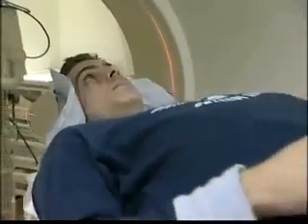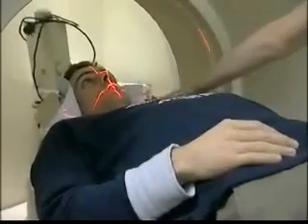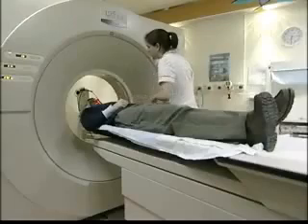Alan is now being placed in the CT scanner, and the radiographer uses a laser beam to place his head in precisely the right location. So what I need you to do there is just keep nice and still.